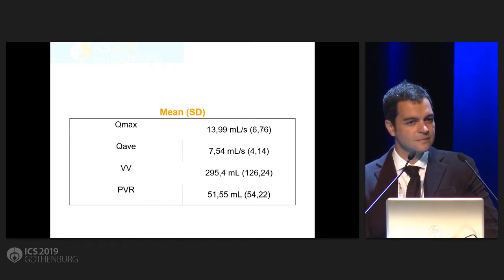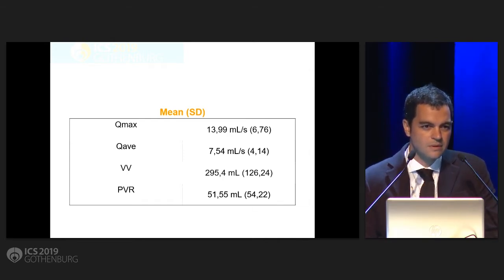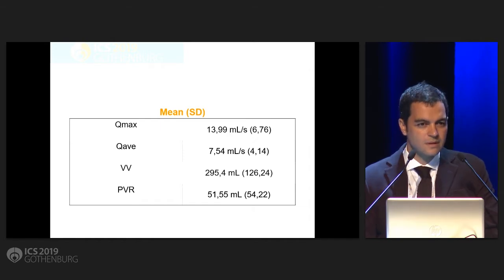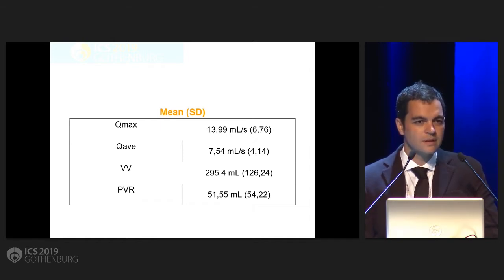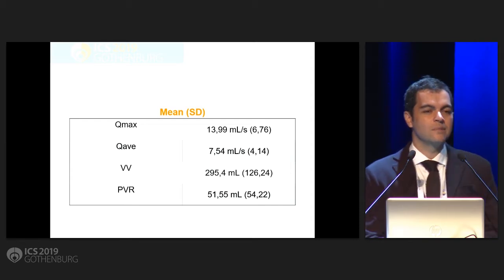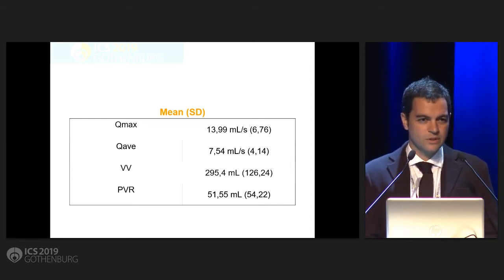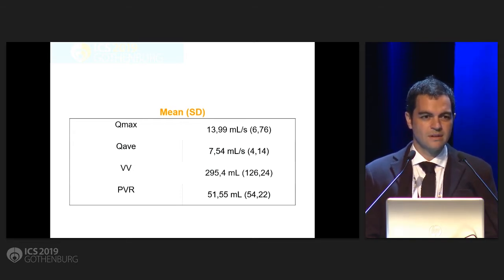You will get a very reliable mean flow in that way. You mean comparing this pictogram with what? With voiding into a funnel in a beaker with volume measuring. Good. So you measure the volume and you ask the patient to record the voiding time with the stopwatch. It can be done on every phone. You will get a mean flow. Can you compare this one with the other one?